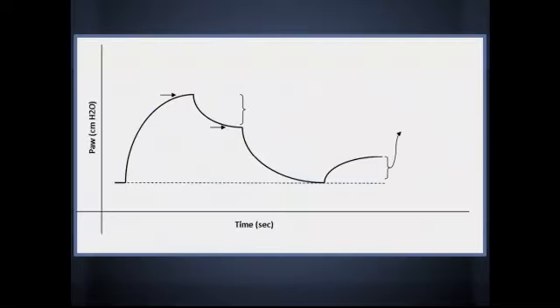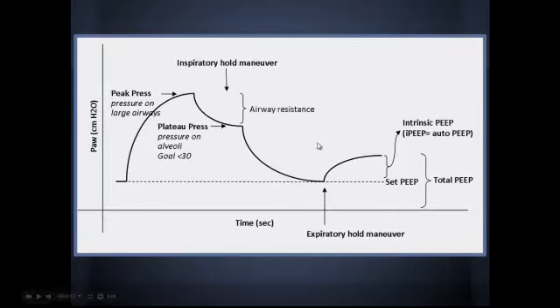So now that we've intubated the patient and put in some preliminary settings, let's take a look at our ventilator. So this is the pressure waveform you would expect on a normal lung. What part of this are we going to look at to indicate the large airways that would have some abnormalities in asthma? Good, so it's the peak pressure. So it's this top part right here. And the peak pressure is the pressure on the large airways. Let's say it's around 20 in a normal patient.